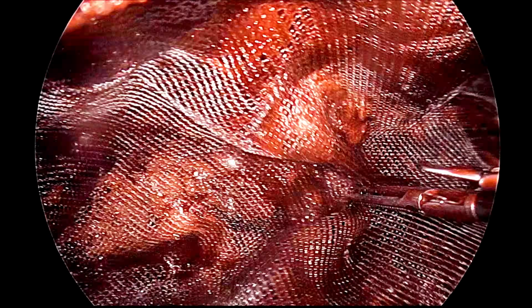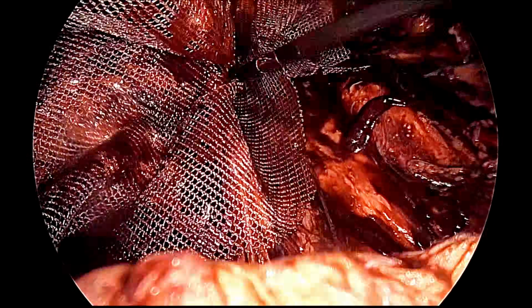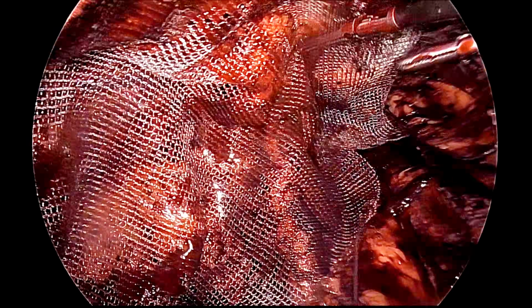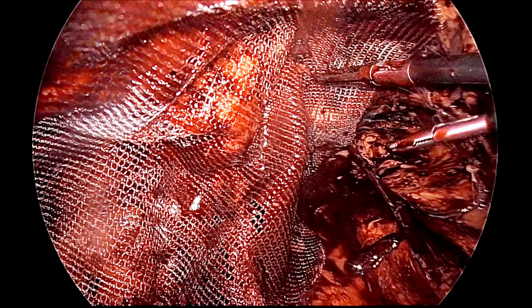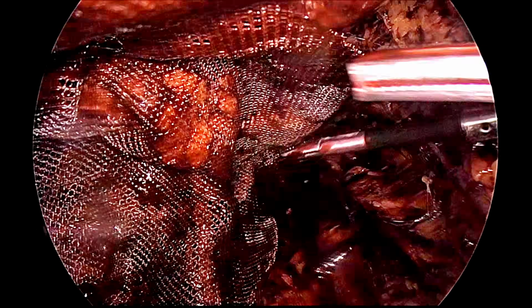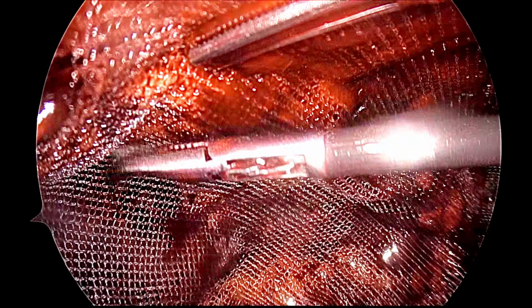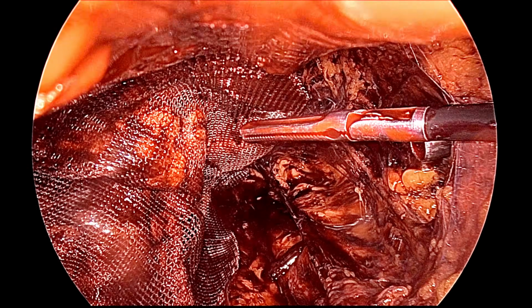So, it is slowly spreading all around, and we can see the Cooper ligament is also visible through it, and it is covering everything. It should cover the inferior epigastric vessel, it will cover the vas deferens, it will cover the spermatic vessel, the arc of transversus abdominis, LFCN, GFN, all it should cover. And it is now over. You can see this is the triangle of doom below, this is the lateral triangle of pain, above is the trapezoid of disaster, and this is the rectus abdominis muscle.